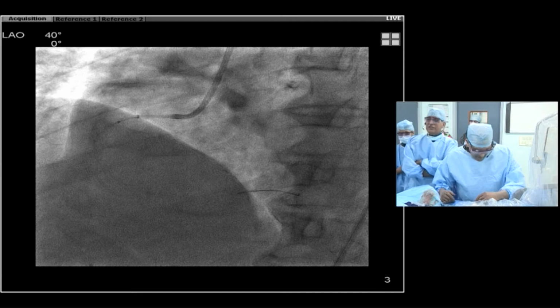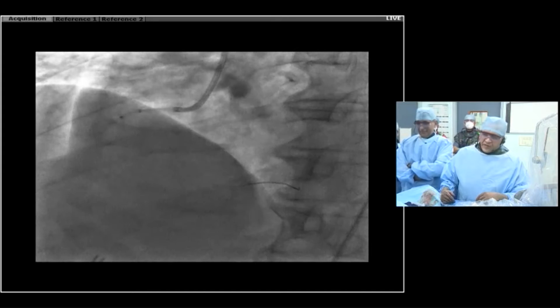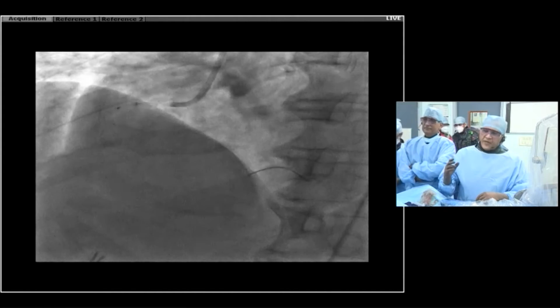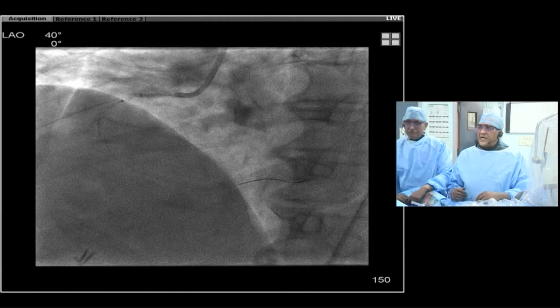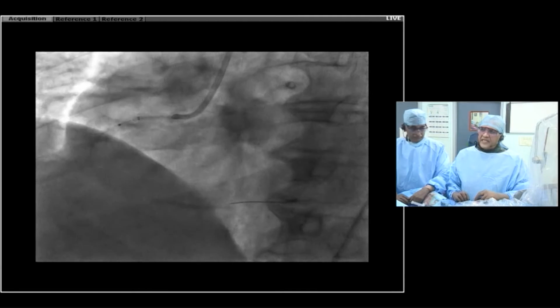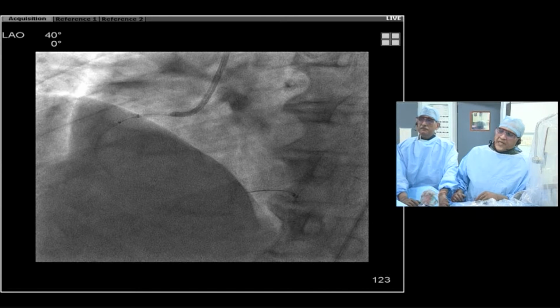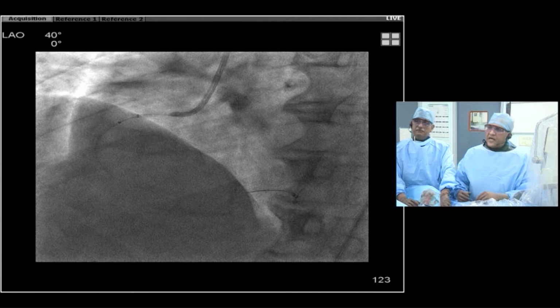All right, so this is where the action begins. Typically in these right coronary arteries, I prefer to use a guide extension catheter to get me close. It keeps my laser catheter very central. It also helps me use very minimal saline flush to clear up the heme. We've got a 0.9 fiber sitting right at the proximal end of that very critical stenosis. In hindsight, I wouldn't call it a CTO at all. One could attempt this with a normal balloon, but I took this opportunity to showcase how an excimer laser could be used if required, if it was an uncrossable lesion.